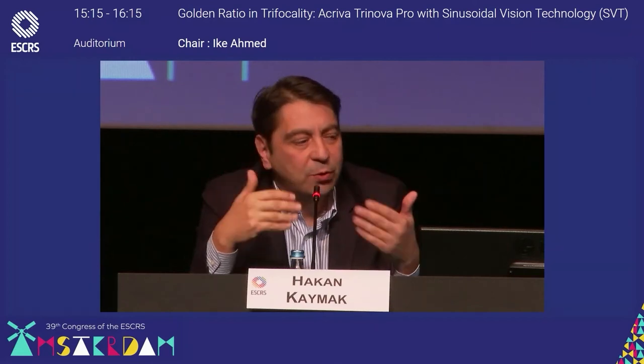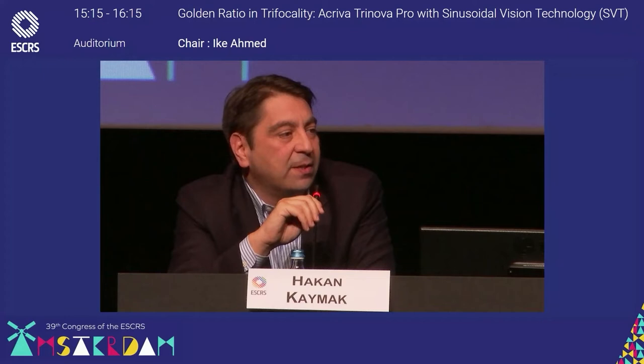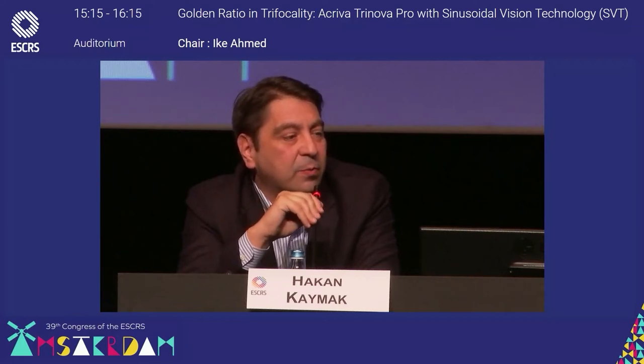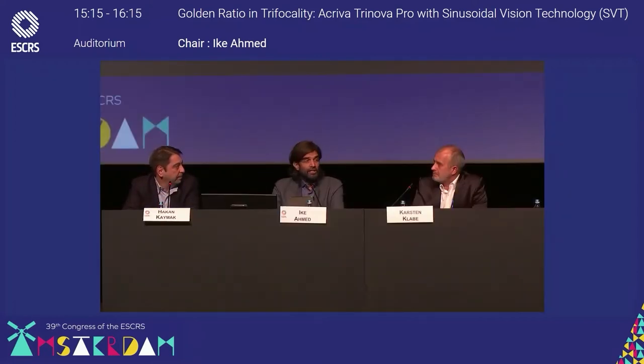And for patients where implanting the EDOF lenses as a new standard, yes, this is possible. If you just want to do a fast job, then it's okay. But if you spend time with your patients, when you are talking about the lenses, when you're explaining to the patients, then I think that's really a great choice and an opportunity for the patients and for the doctor. Yeah, I think with the light transmission that we're seeing, like 93%, that addresses some of our concerns with contrast.